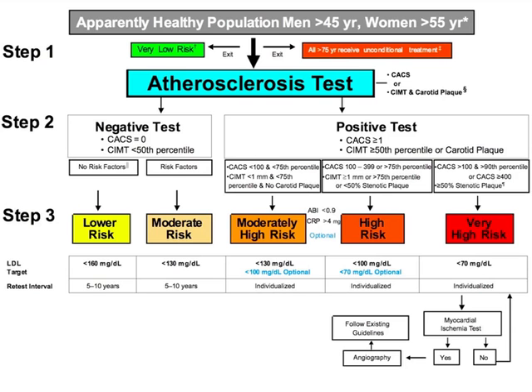And I'm not going to walk you through this whole pathway here, but you can imagine how, if you're working in primary care, you could take this type of data and combine it with some type of algorithm to decide at what risk your patients are. So if your carotid intimal medial thickness, here it is less than 50th percentile or greater than 50th percentile, or you actually visualize a carotid plaque, which is an actual part of the carotid artery that is severely narrowed from a plaque on it, then there are other factors going on here.